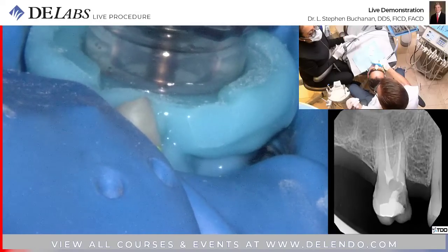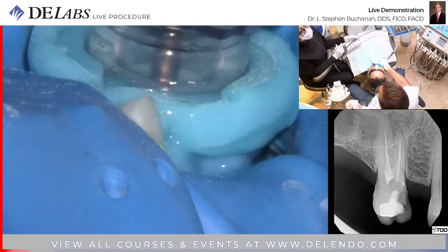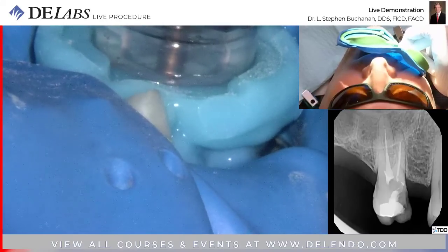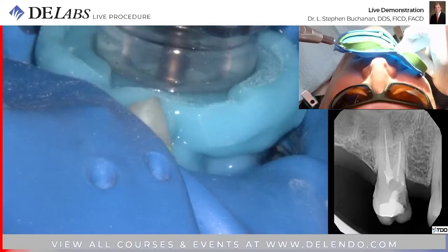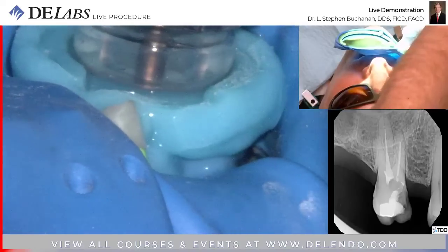2 minutes and 21 seconds. We're halfway through the hypochlorite segment of this entertainment module. Yeah, I can't stand the wait. It's like 8 minutes, it's like 8 seconds in bull riding. Less exciting, but it's a long time. Let's just put it that way.